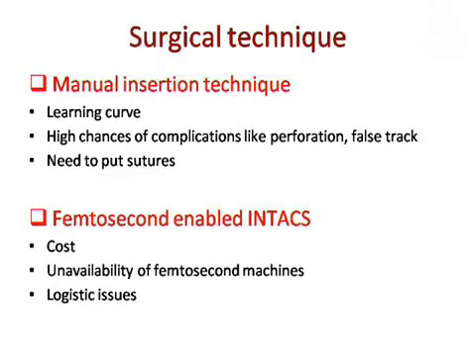So coming to the surgical technique, there are two methods which can be used for the INTACS. One is the manual insertion technique, in which the learning curve is slightly on the higher side, and it has a high chance of complications like perforation or false track formation, and we need to put sutures also. While in femtosecond-enabled INTACS, the cost is the main limitation, and unavailability of the femtosecond machine is another limitation.